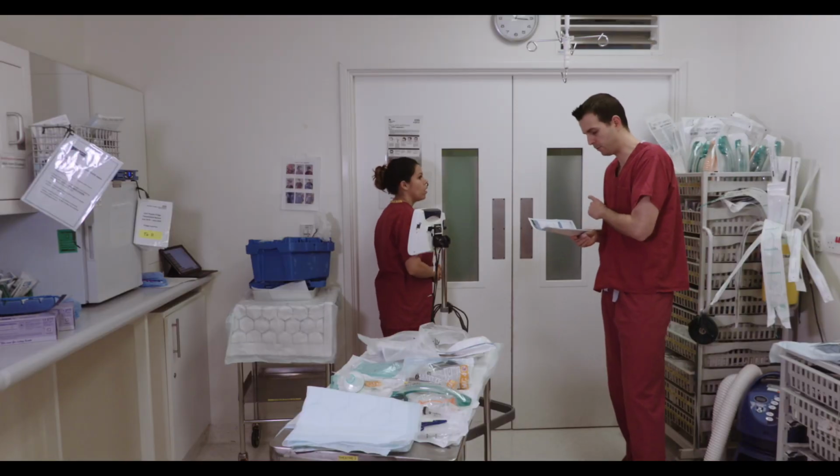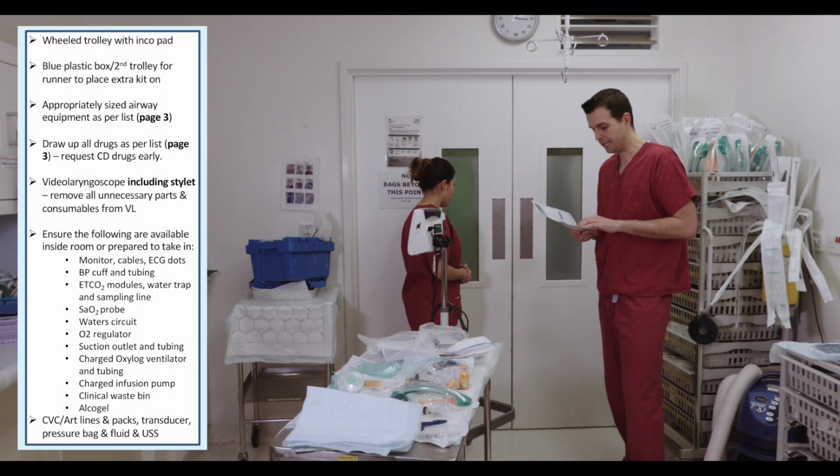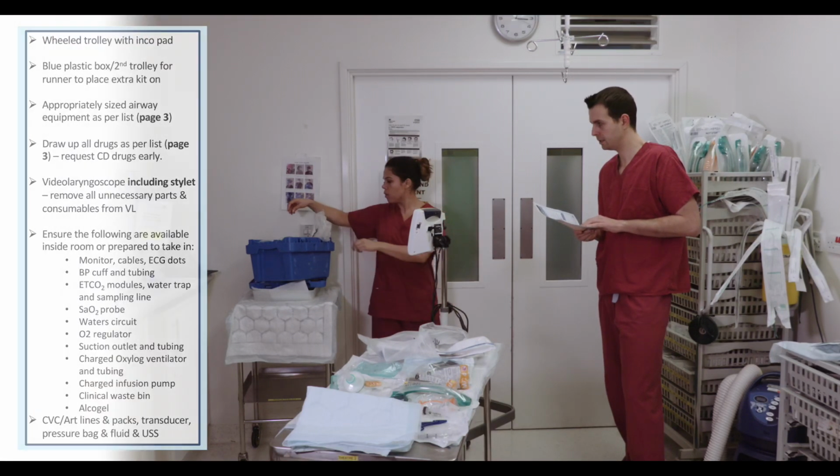Can you just check what's inside, just looking through the window without opening the door? Check equipment list and clarify whether anything else needs to be brought into the room. Extra kit should not be handed directly from the runner to the team in the room. It should be placed unopened on the floor or on a trolley that can be slid into the room.